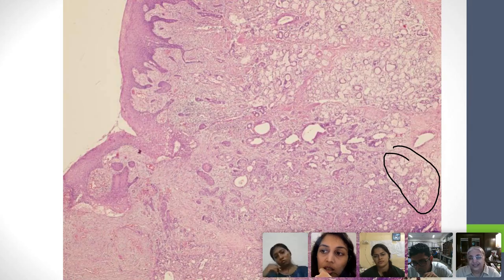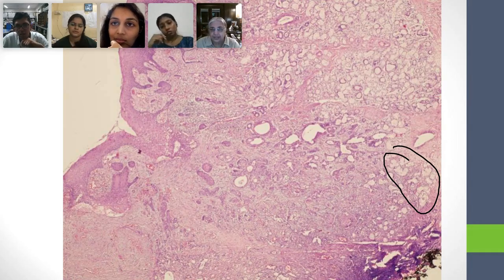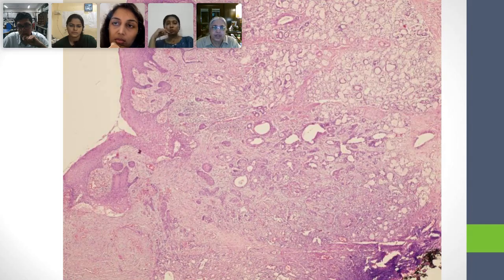Glands. Yeah, they're acini. So you've got acini here, acini here. There are no glands, okay? This whole thing that we said was a lobule of a minor salivary gland, that is an anatomical gland. Histologically, you can't call it a gland.